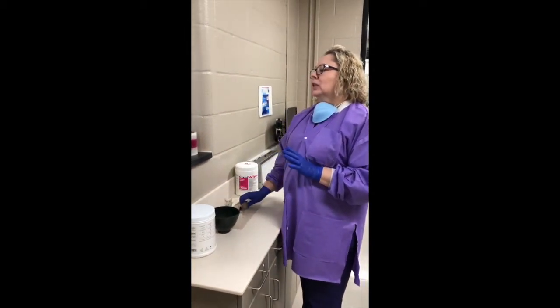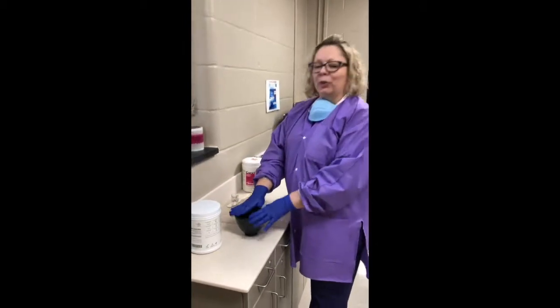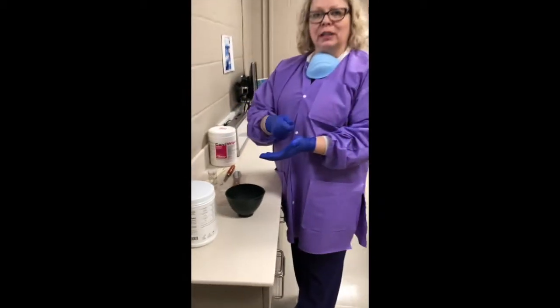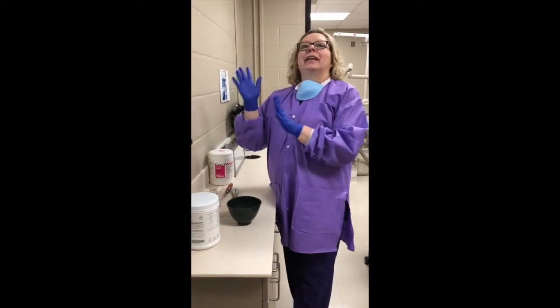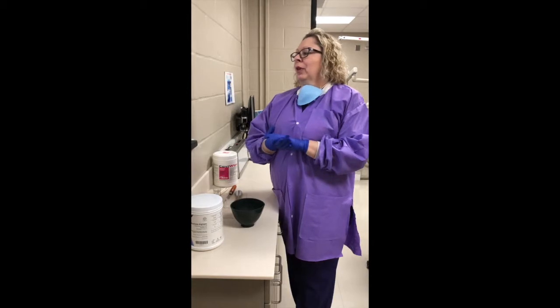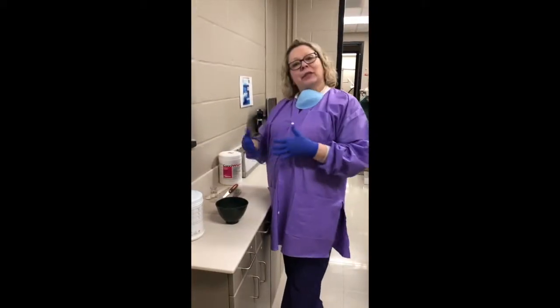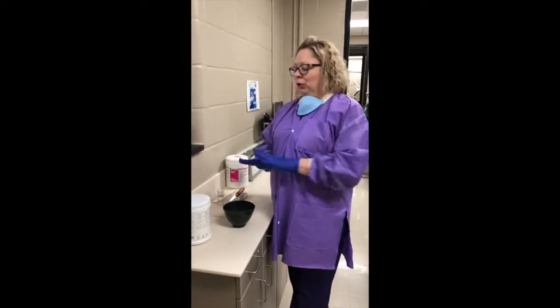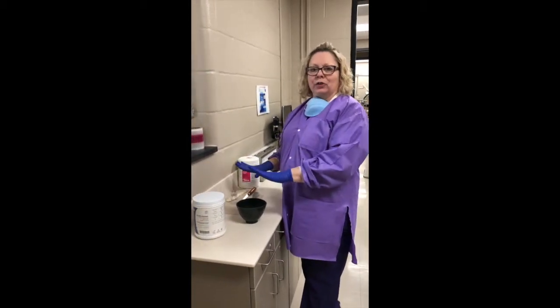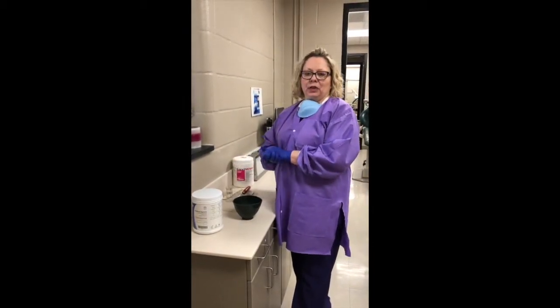And then once the water and the powder are both in here, we have to spatulate it correctly to make a nice smooth consistency before it's placed in the tray to be placed inside the patient's mouth. So there are a lot of little steps to it, but it seems kind of complicated until you start doing it. You do the same procedure on every single alginate impression you're ever going to take, and so over time it becomes very second nature to us.